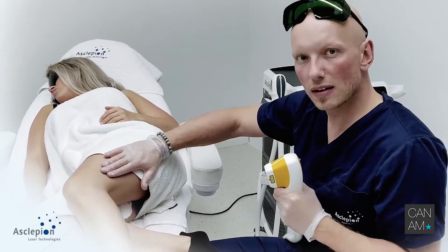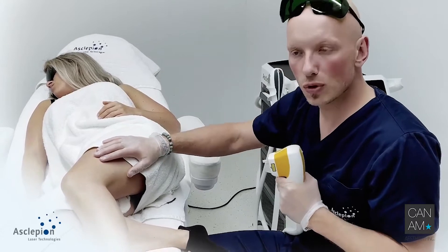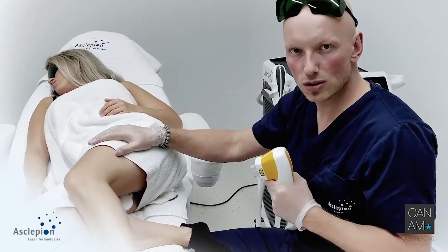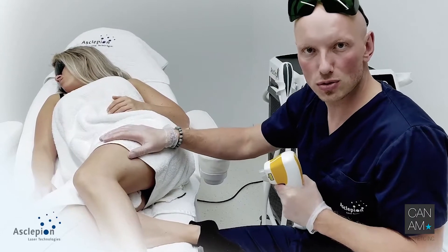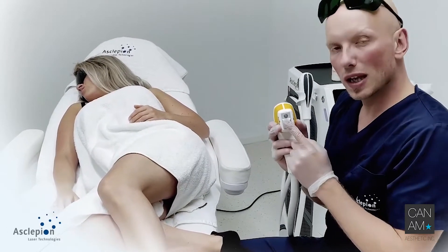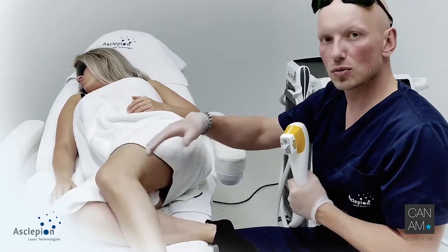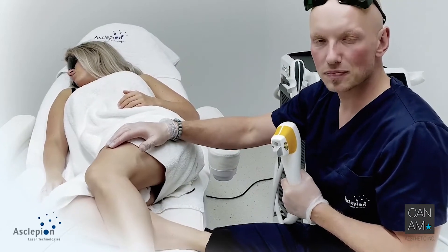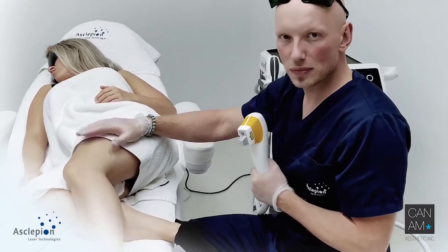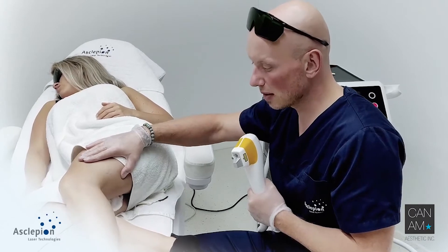We prepare everything: patient consent and photo documentation. You can cool a little bit. You should not worry, especially with telangiectasias or hemangiomas, about vasoconstriction, due to the fact that it will not constrict so much. In telangiectasia, it might be different. It's okay to use just the cooling tip for about 2 to 3 seconds. If you would like to be super safe, you can go for a cool pack — not an ice pack. So 4 to 8 degrees is best in order to avoid any freezing reactions on the skin or hypothermia problems.